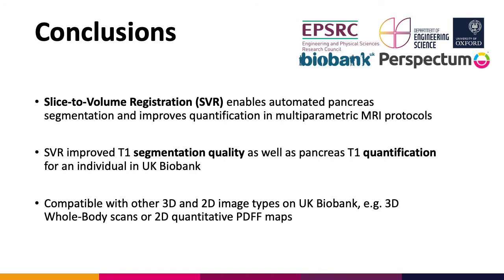SVR improved T1 segmentation quality, as well as pancreas T1 quantification for an individual in UK Biobank. Our method is compatible with other 3D and 2D image types in UK Biobank, for instance the 3D whole body scans or 2D quantitative PDFF maps.